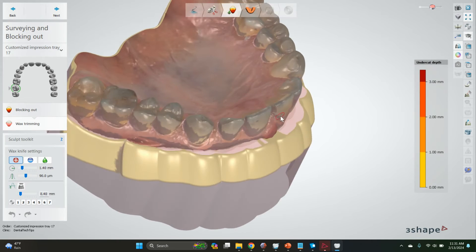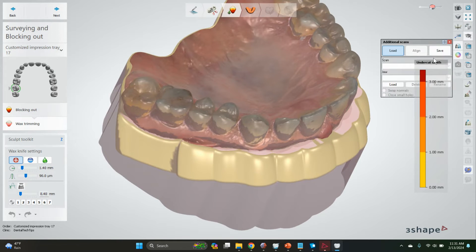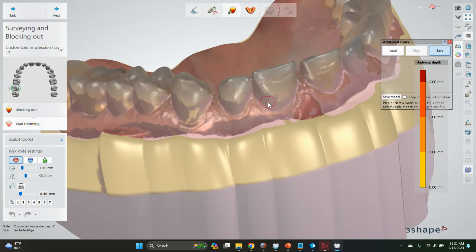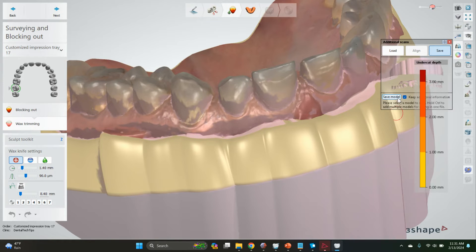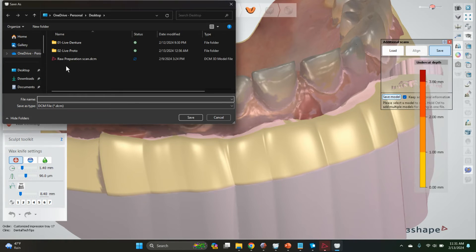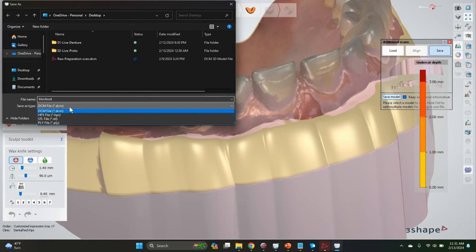Now we have this blocked out model. I'm just going to go over here, click save, click on the purple model, and save the model to our desktop. Block out - we'll save it as an STL.